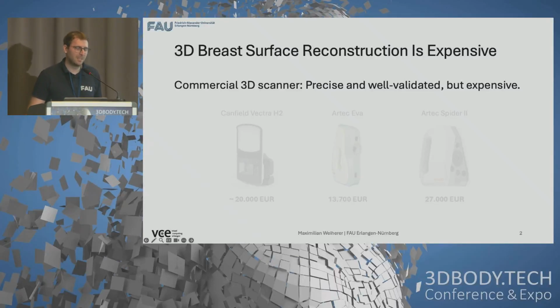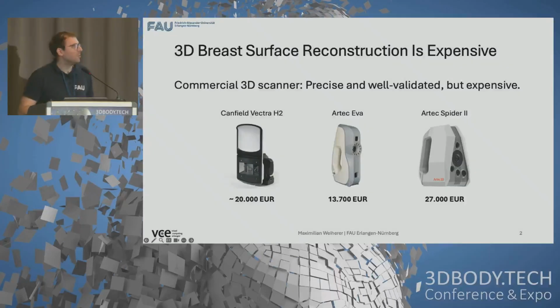from companies such as Artec, Canfield, 3DMD. These scanners are quite costly, and they involve special hardware and software. So these are quite big numbers, and as you can imagine, not every hospital or clinical facility is actually able to afford such a system.